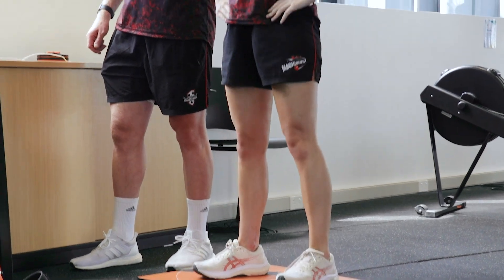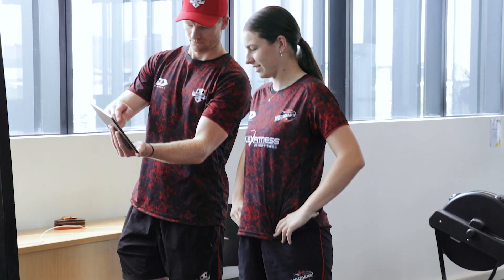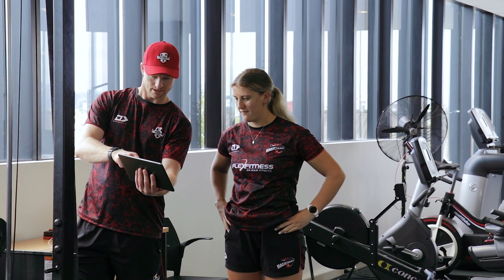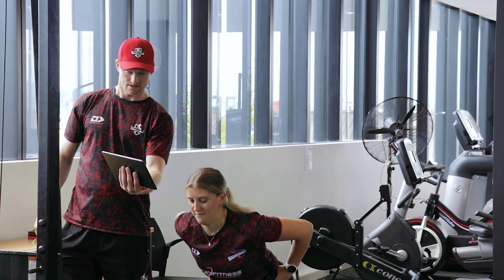One we had a look at earlier is what's called a counter movement jump, so it's just having a look at peak force — actually how much force they're able to generate on their left limb versus their right limb. Basically deceleration asymmetries as well, so basically when they land it's one leg working harder than the other, and vice versa when they're taking off.